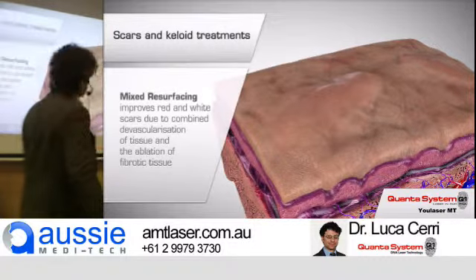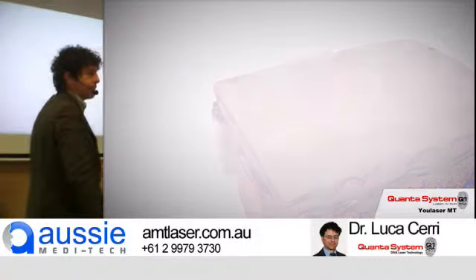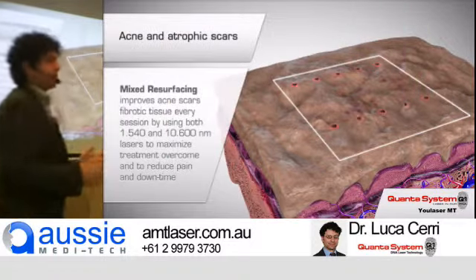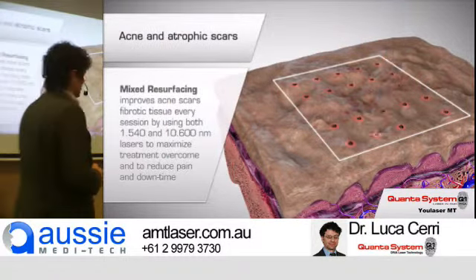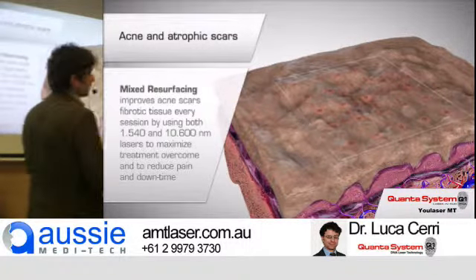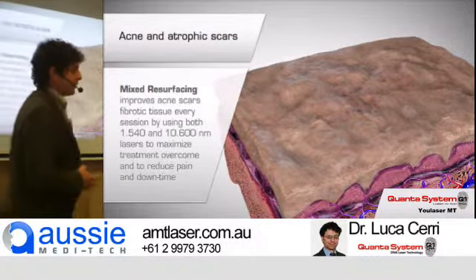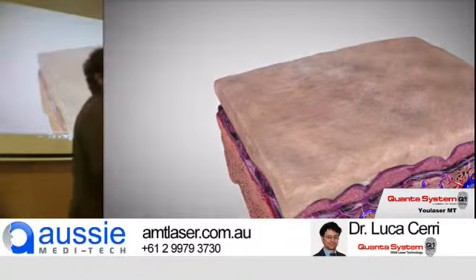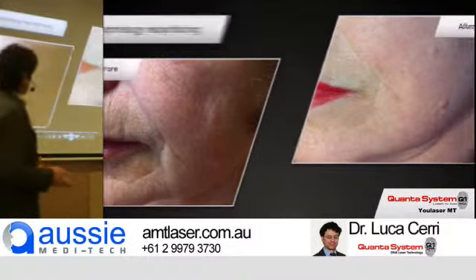For scarring, if we have a white, hypertrophic scar, the 1540 is not really playing a big role. It's the CO2 that is ablating the scar. But if the scar is unstable or is red, it must be stabilized before, and the 1540 is doing that. So in 90% of cases, they must be used together.